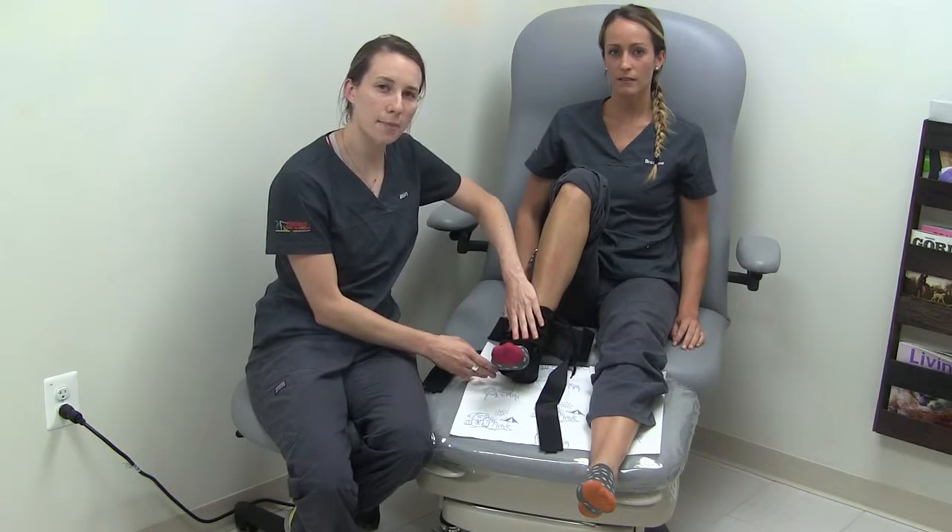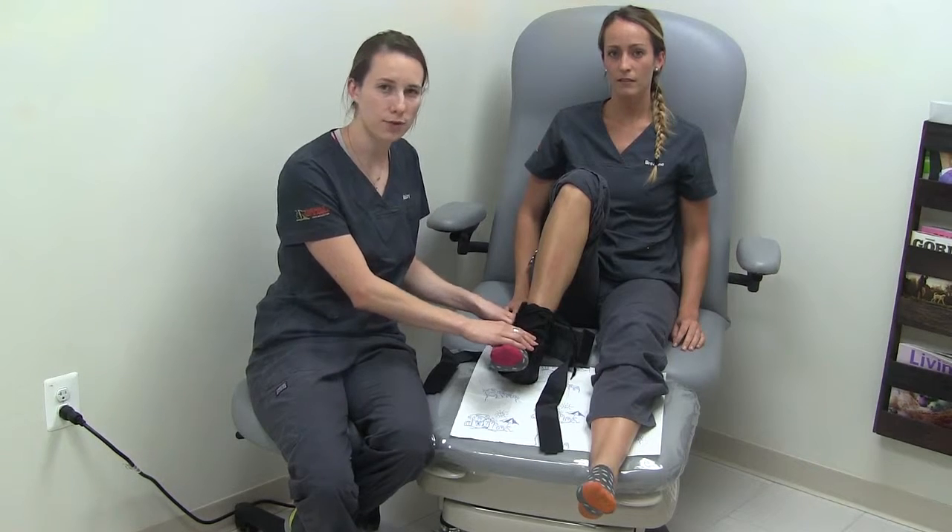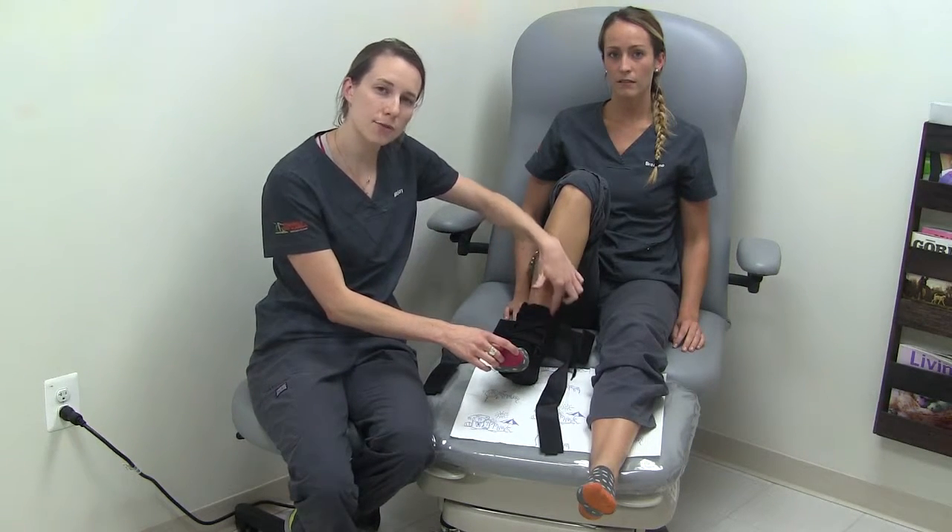With the tongue at the top, lace up your brace like you would a boot or a shoe, making sure that your ankle stays at 90 degrees with your foot.